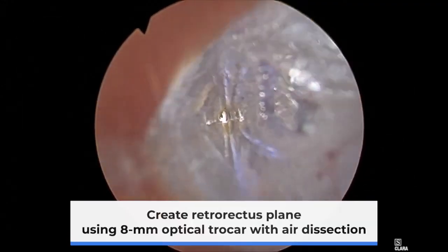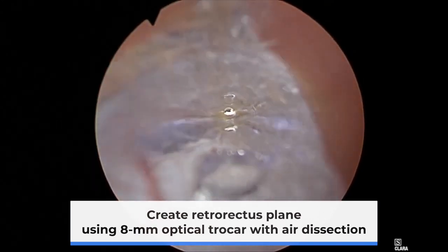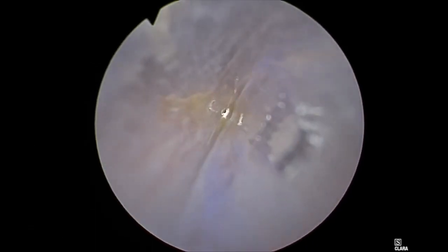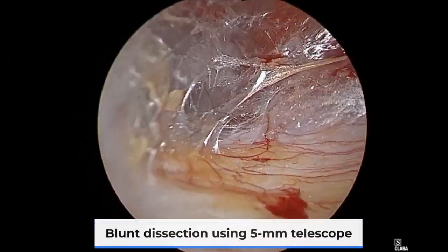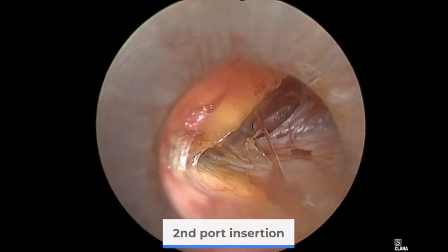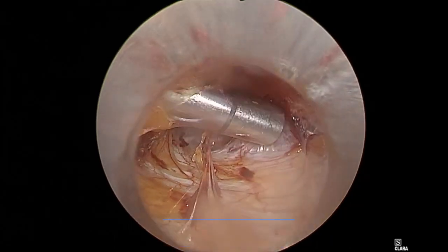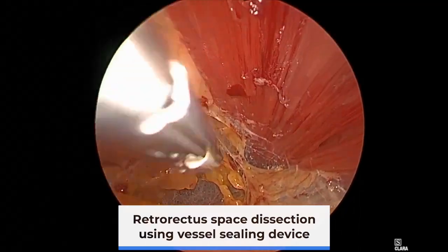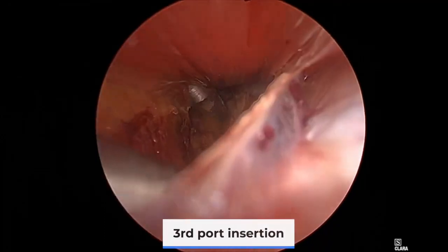We began with retrorectus plane creation using an 8mm optical trocar with air dissection. Continue blunt dissection with 5mm telescope. Second port insertion. Continue retrorectus plane dissection. Third port insertion.